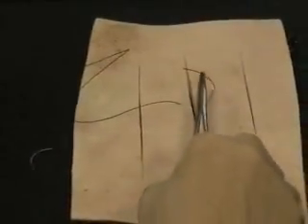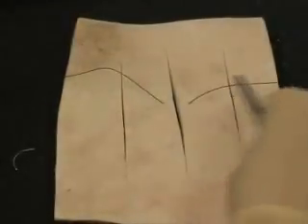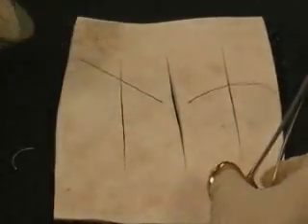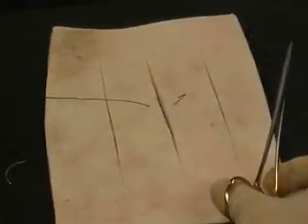The other thing you want to do is avoid grasping the tip of that needle. It will dull it. So we're going to grasp down here, and pull all the way through, and we're going to leave about an inch of the tail and just drop the needle down onto the field. It won't cause any trouble. This is a sterile field. The reason that we pulled it almost all the way through is if we left a big long tail, all of this is going to be cut off and get wasted. So you really want to try to maximize your suture, because we're going to try to get some more stitches in with this particular length of suture.